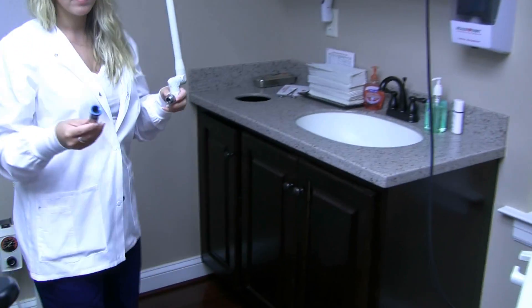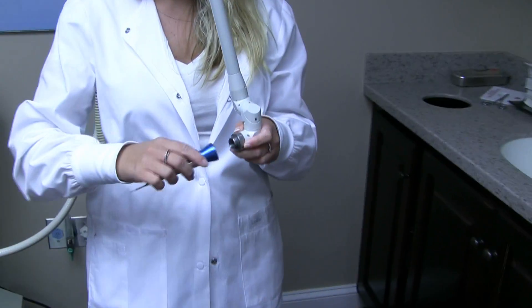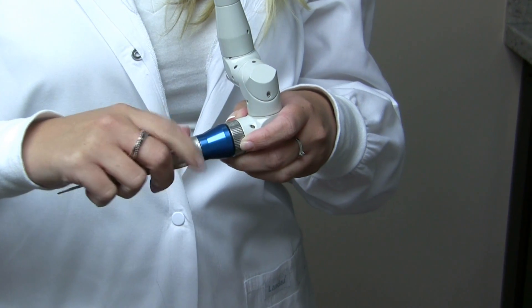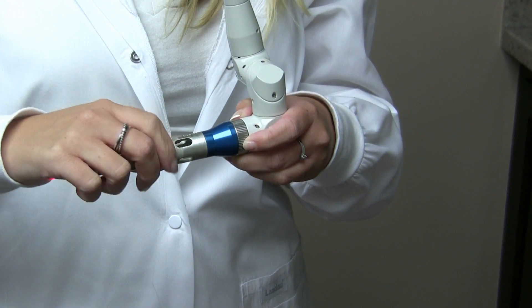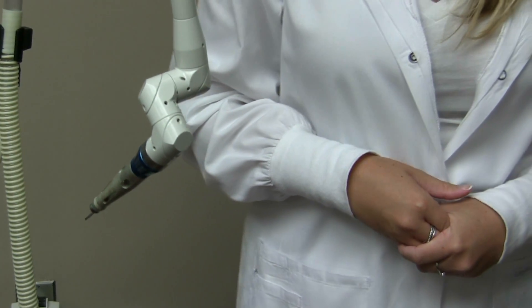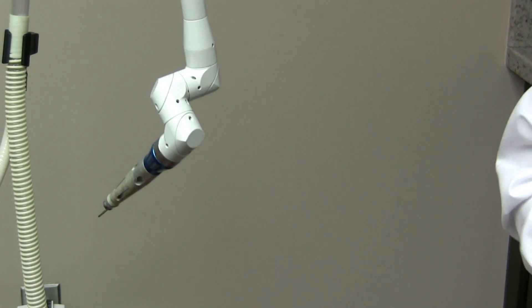She comes over here and it just connects, then screws on. She is holding that silver piece because it will spin and tighten, so you have to hold that silver piece on the arm and then hold the blue to tighten it up.